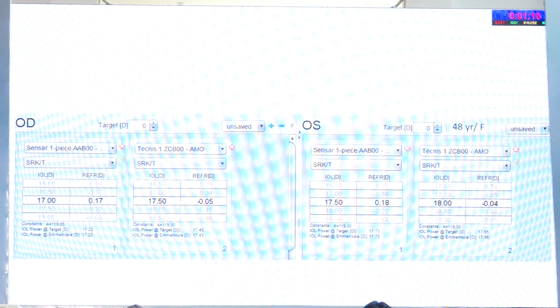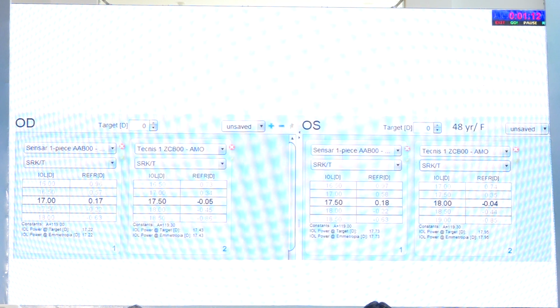Post-refractive surgery eyes are definitely a nightmare. This patient walked in for cataract surgery. These were the biometry values. Usually it is mathematically expressed. There are various wavefront aberrometers available.